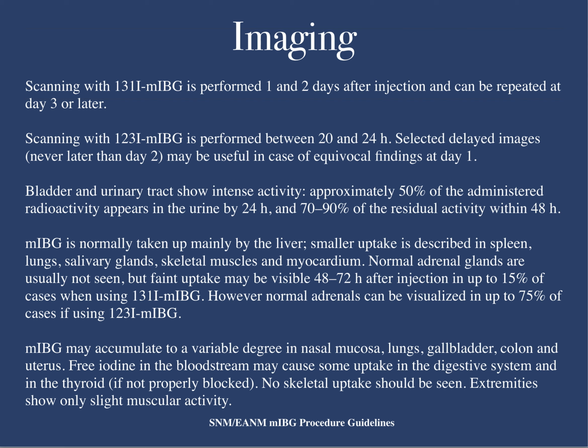Imaging with I-131 can be done for many days after the injection because of its long half-life. With I-123, it's typically performed a day later, so it's 24 hours after the injection. Occasionally, we will do delayed imaging, but typically a day after the injection, the answer is pretty clear. Normal uptake can occur to variable degree in nasal mucosa, lungs, gallbladder, colon, and uterus. There can be some uptake in the digestive system as well as the thyroid if the thyroid gland was not properly blocked.